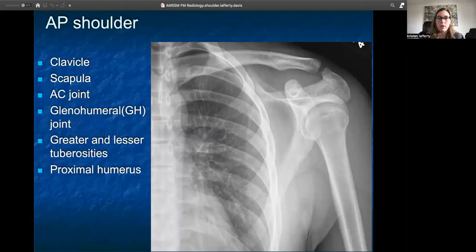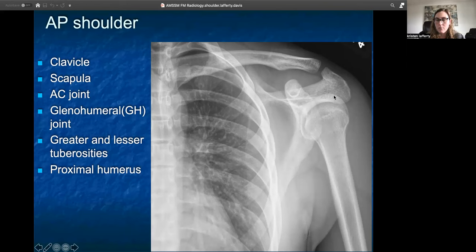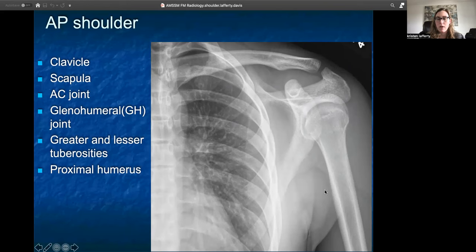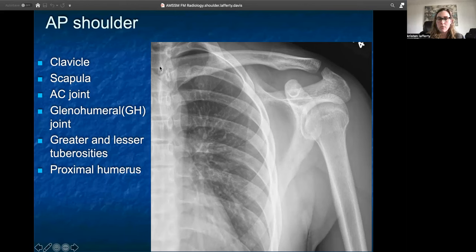Starting with your AP radiograph of the shoulder, this helps look at a lot of the bony anatomy of the shoulder itself. You can see the clavicle coming across, your scapula all the way through the back, your acromioclavicular joint — the acromion and clavicle and the joint between the two bones — and your glenohumeral joint with the humerus, the glenoid, your greater and lesser tuberosities off of the humerus, and the entire proximal humerus. Don't ignore surrounding structures such as soft tissues, individual ribs, the lung, and what's available of the heart. You can also see vertebrae.